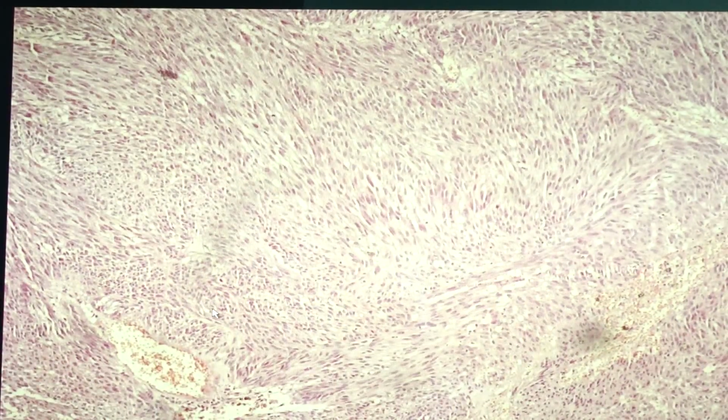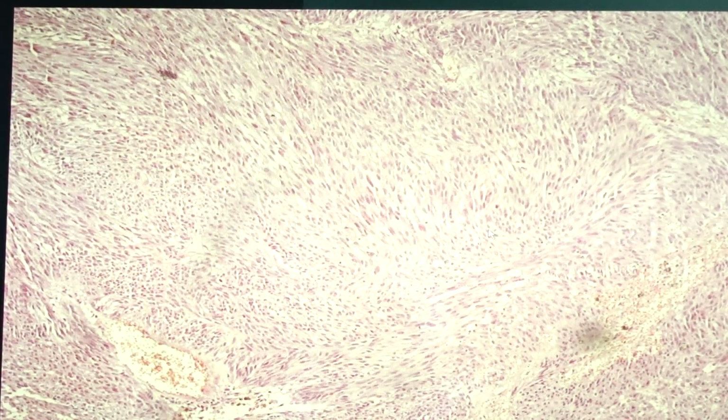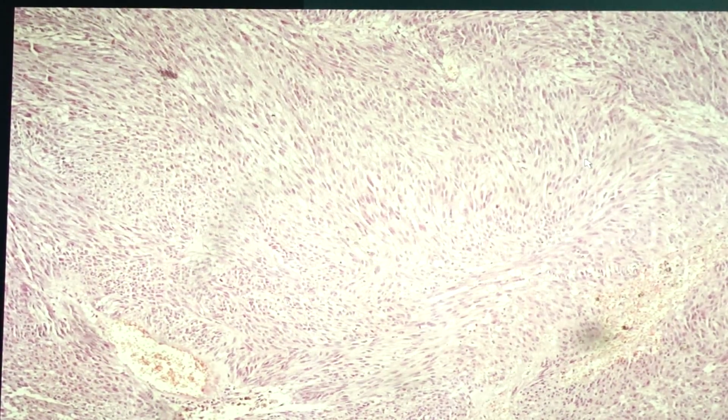You can have interlacing patterns of smooth muscle fibers. Let's go to the higher power. You have here the circular, longitudinal, some circular, longitudinal pattern.